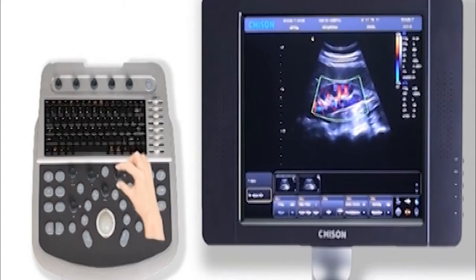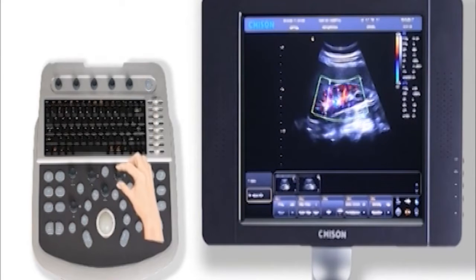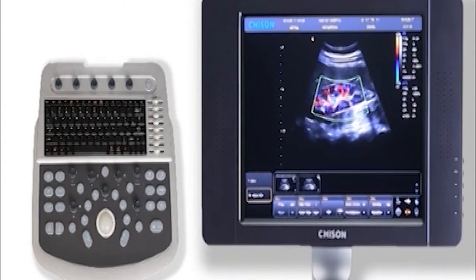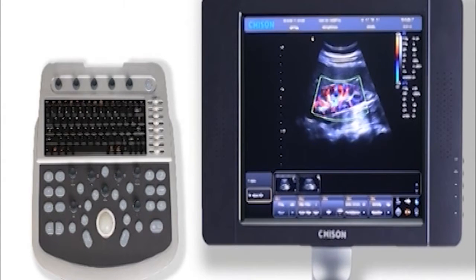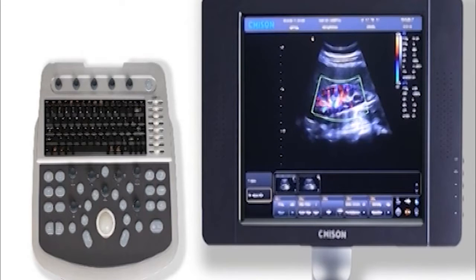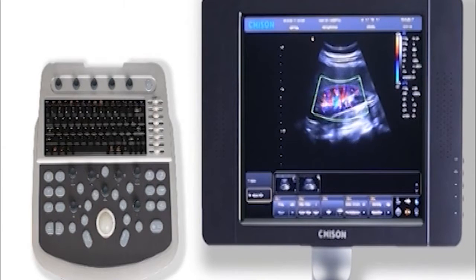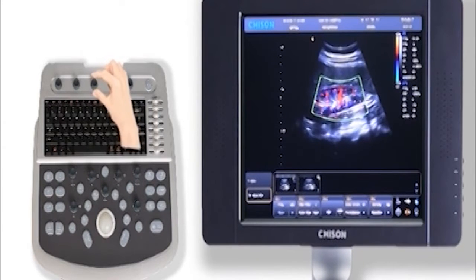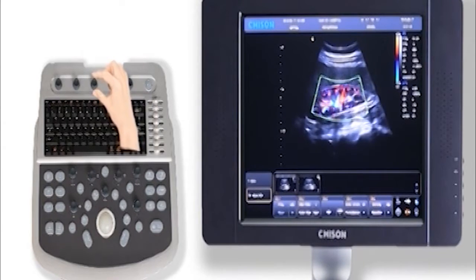Rotate the key to adjust the color gain to reach a reasonable level, so that the blood flow will not exceed the vascular vessel or disappear from the vessel.